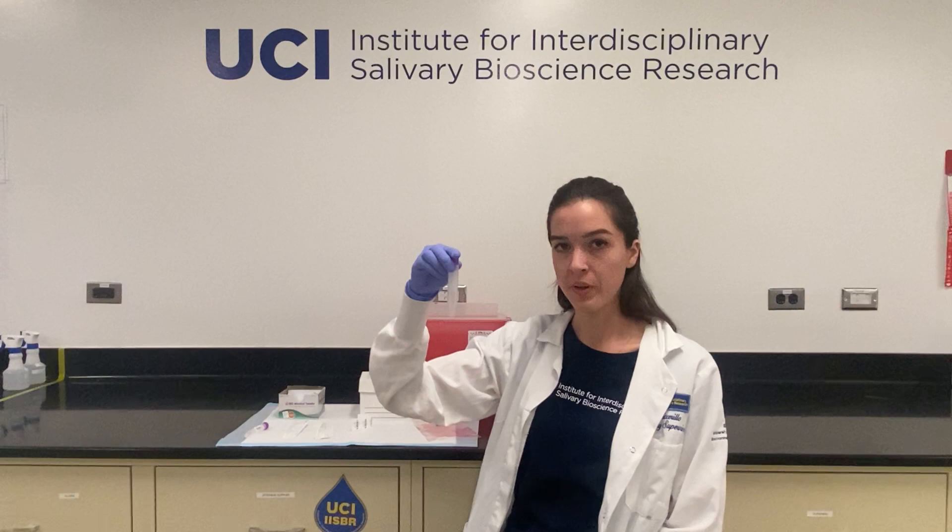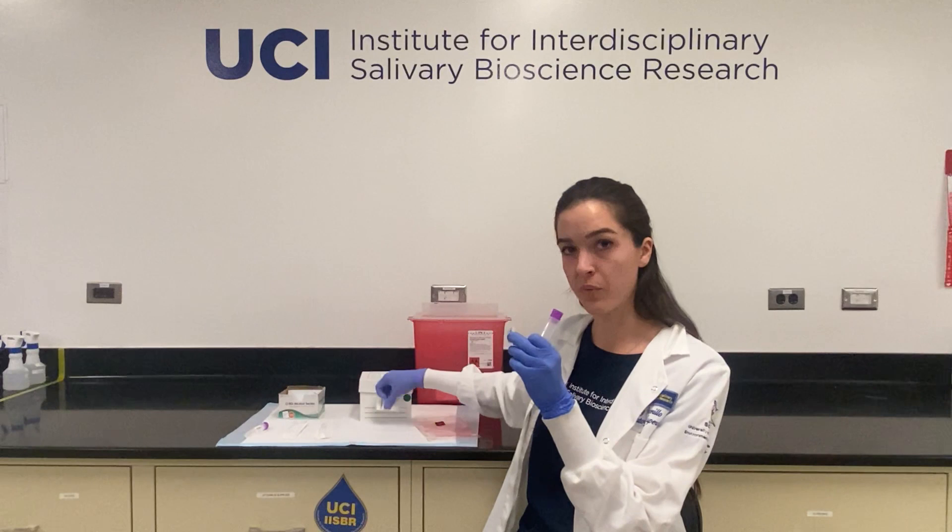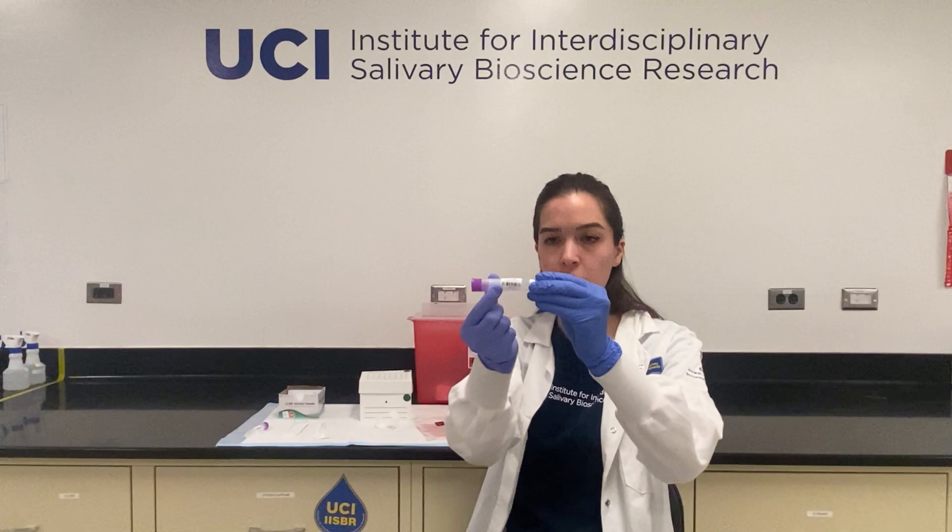When you're ready to collect, you'll first grab your tube. If your tube is pre-labeled, make sure that you're selecting the tube with the correct label. If it's not labeled, you'll take your labels that you were given, select the right label and place it on the tube so that the barcode runs lengthwise along the tube.